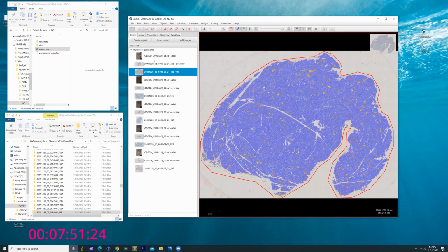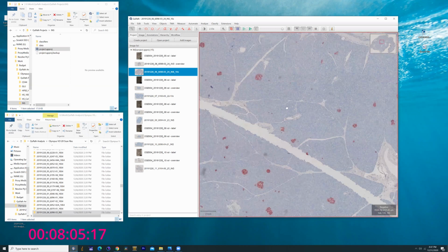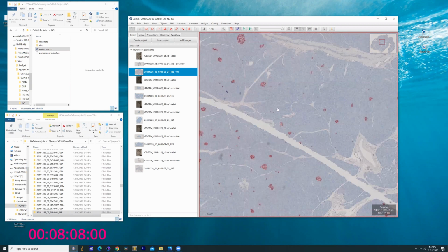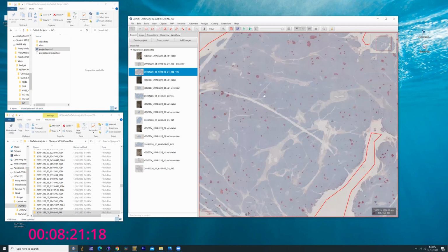And as you can see, as you import this, and actually we'll go through this process in just a second, you can build and keep on adding until you have hundreds of slides. But the key point is that the actual image, this underlying image, is just an imported image from the previous directory. So this is why it's important to maintain directory location. There are ways to relink it, just like you would with a program like Lightroom or Premiere for video, or a lot of other large file database software where you're initiating changes on a virtual copy of something that's stored in a larger location.